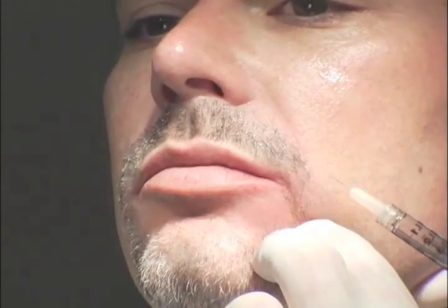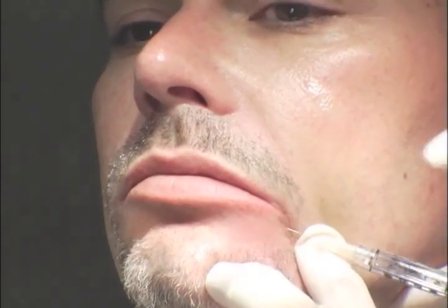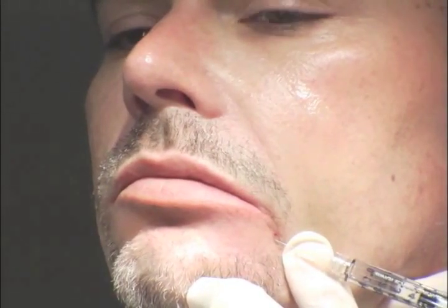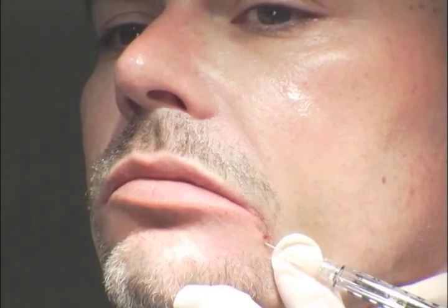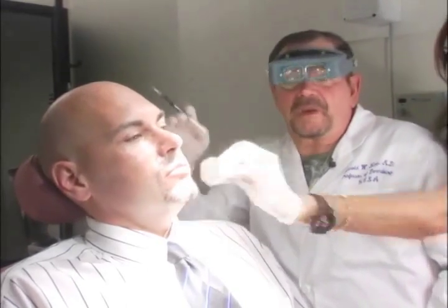Now, we want to build more of an anterior flying buttress also there. So we're going to go now more anterior, just like that, and build another little bit of the buttress there. What we're doing is building a buttress that's going to hold up the lower third of the face. We pull that out. We just made it flow all into the space. Now, take a look at that. Let me just take a look over here, and let's turn it, and that looks perfect.